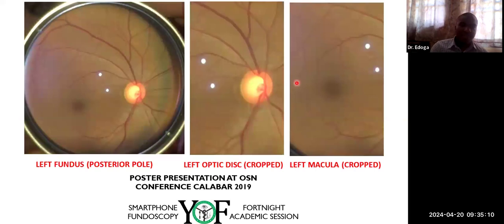So you can see, if you use this setup, you have a wider field of view. It's more than 50 degrees now. It will be approaching up to 60 degrees, 70 degrees if you use this.